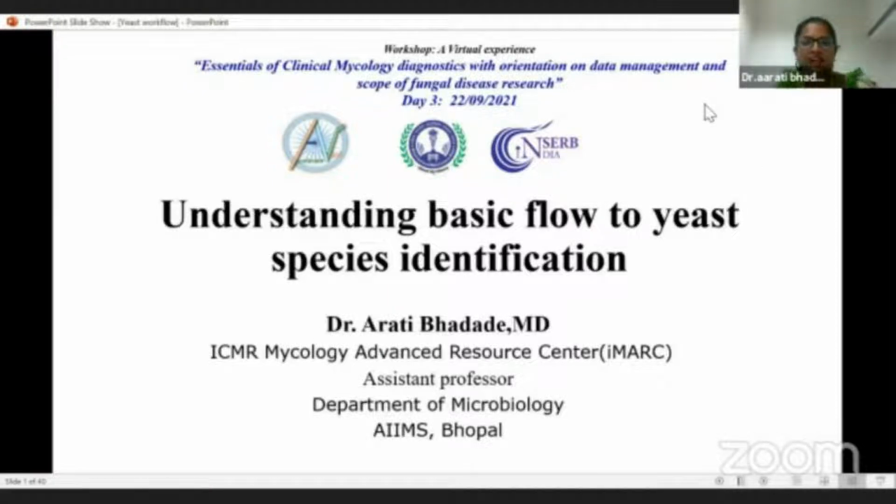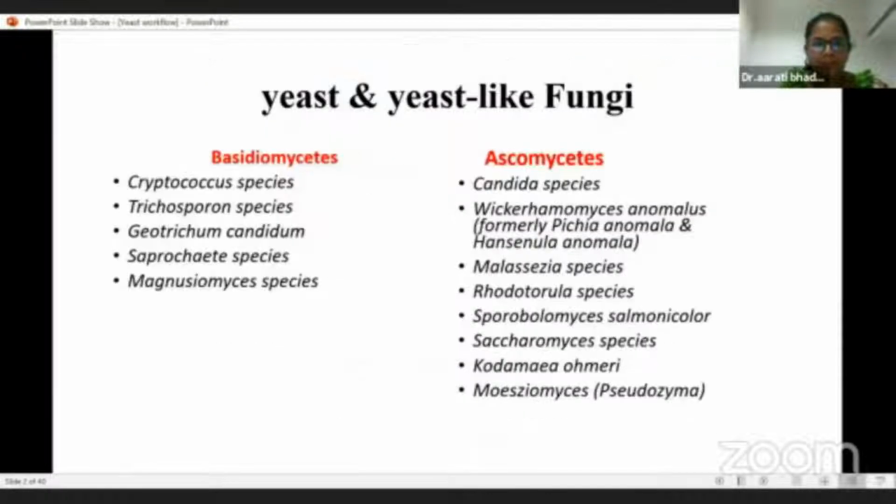In this video, I will be discussing the basic flow to yeast species identification. First, whenever a yeast colony has grown, we have to keep in mind these options. The yeasts are either Basidiomycetes yeast or Ascomycetes.